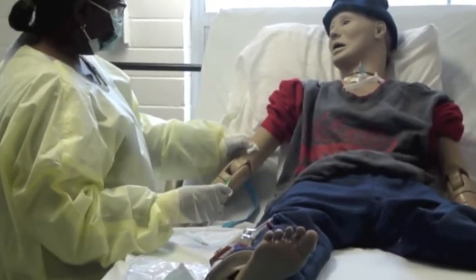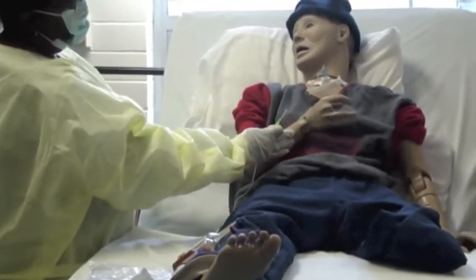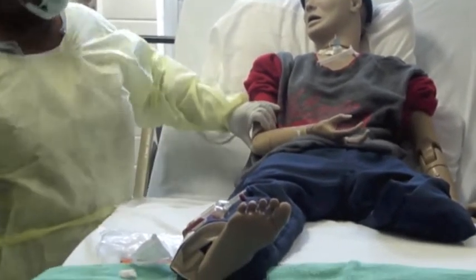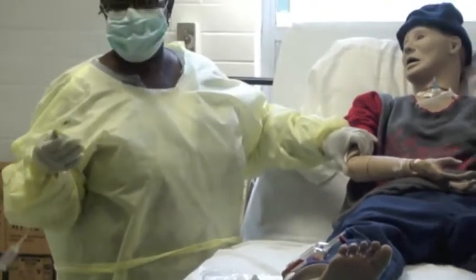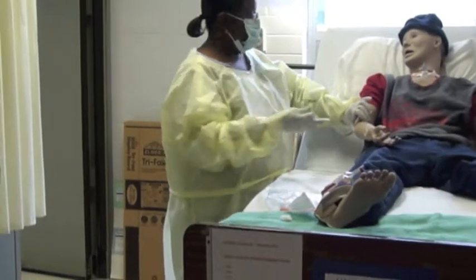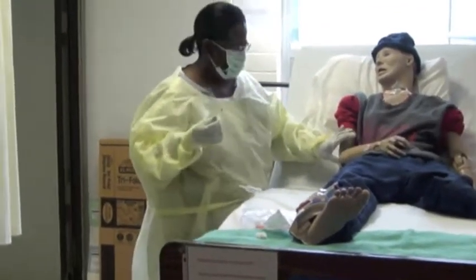Can you apply pressure for me or bend up your arm? Does it look like I can? Well, I'll help you hold that, okay? All righty. So, if we needed to have a dispenser there and we don't, could be your reality right here. Sir, I really need for you to hold this here for me. And they're usually able to bend up their arm like that. I'm just dealing with a mannequin that can't, okay?